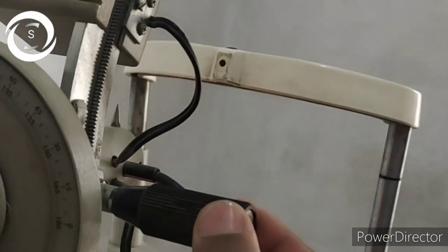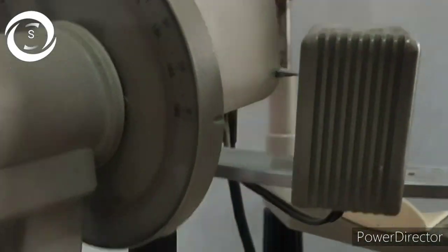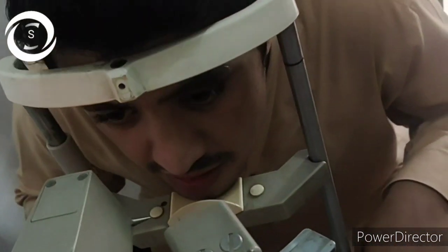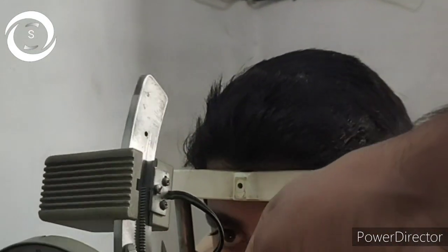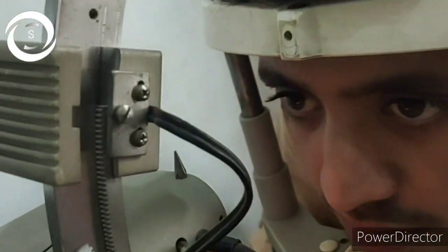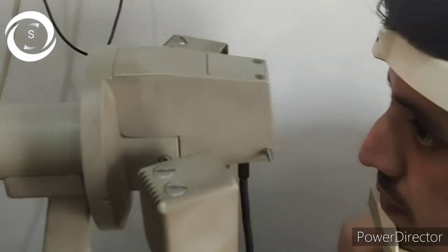Look into the eyepiece, patient well seated. Now that is the knob and you can see that's how you change it. Like now it is focused for K1 reading at 90 degrees and now for 180 degrees. And this is the knob so for K2 here and that's the joystick. With the joystick to and fro motion, while looking into the eyepiece we focus the image on the cornea. Now patient is well seated.